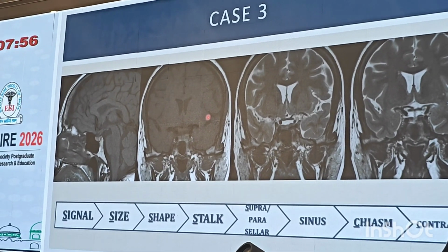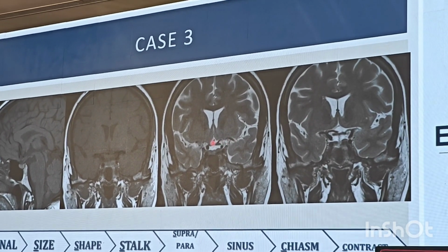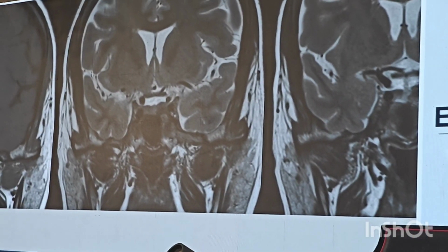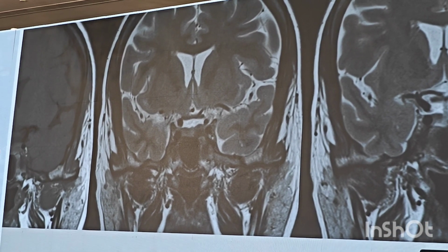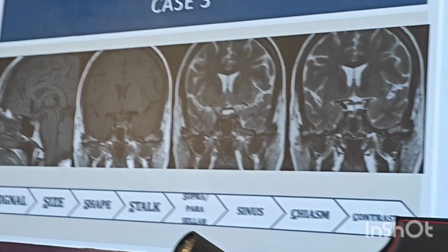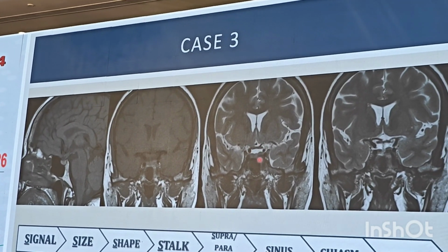But is there anyone who can point out something abnormal in this case? I want you to pay attention to this image. Can you look at this image and show me if anything is abnormal? Yes, so there is something suspicious here, right? The suspicion is in this location.